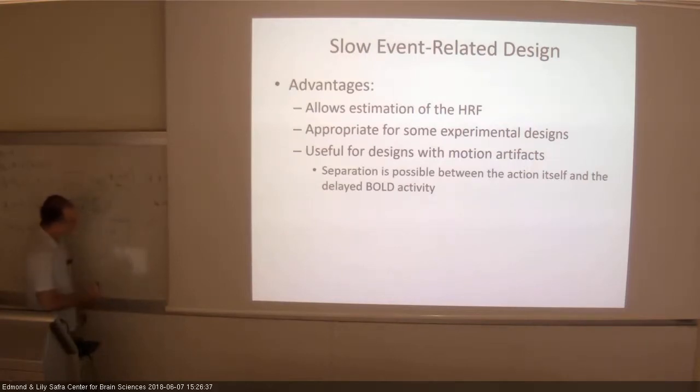When you have, let's say, a block design, and the task creates motion artifacts, I hope that you see this slide, but if this is the block and you have motion artifacts along the block, you don't see the actual response function for every stimulus, you see the whole thing, so it's very hard to tease out the motion artifacts from the stimuli.